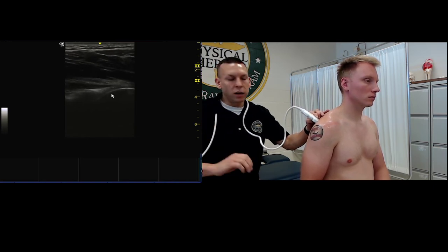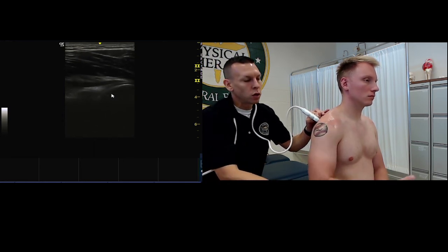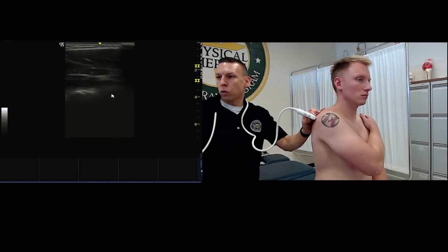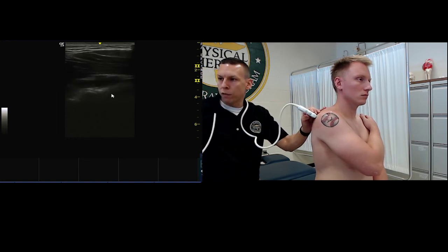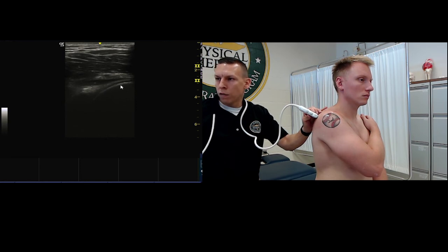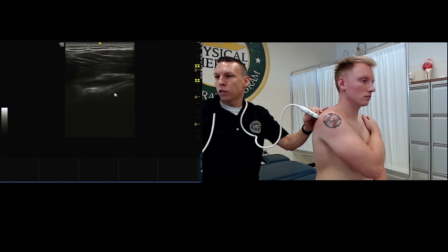Another way you can visualize this even a little easier is to take their hand and put it on their opposite shoulder. What this does is give you a slightly better view of the humerus and glenoid here. So you can do this as well.